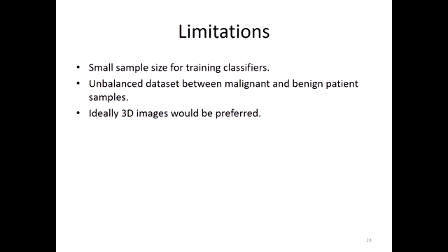And that somewhat comes with the territory, because obviously if we're looking at a radiologist pointing out regions of interest for biopsy, they're trying their best to not over biopsy. So they're trying their best to say, yes, these are malignant, go biopsy. And the fact that they get benign means that they saw something that maybe looked malignant, but it was still benign, so that was over biopsy. It didn't need to be biopsied. So we tend to get unbalanced data sets.